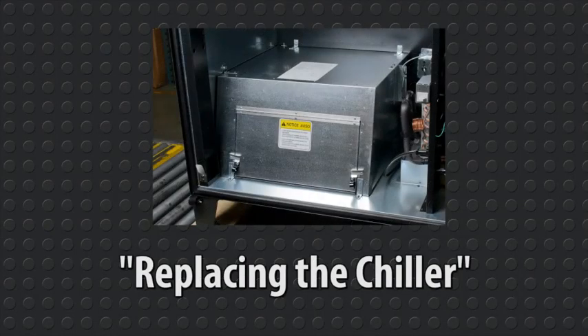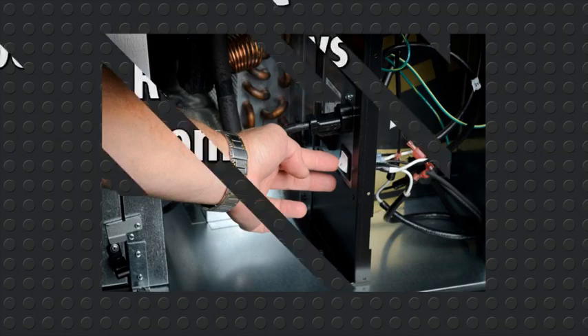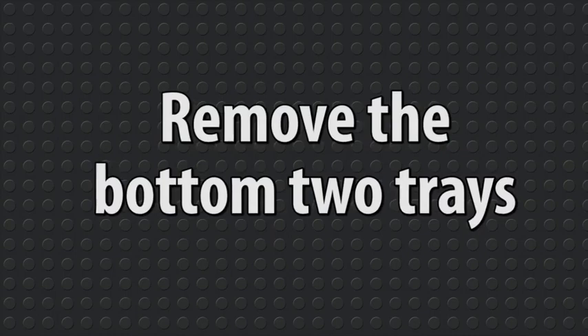Replacing the Chiller. Power the machine off using the on-off switch located to the right of the refrigeration unit. AMS recommends you then remove the bottom two trays.